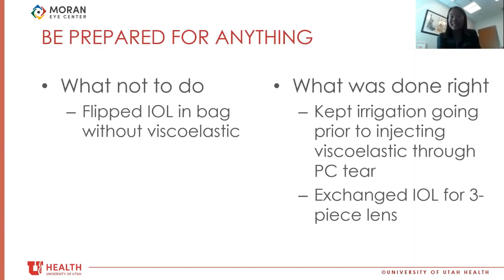Yeah. I ended up leaving one IOL upside down, and it was a case where I thought it would be best to do so. And with that particular lens model, it seemed to be okay. So, looking back at it, it was okay. I guess if I had known more about the optics, whether it's convex surface or biconvex, or the toric, all that kind of stuff you would have to know, it'd be interesting.